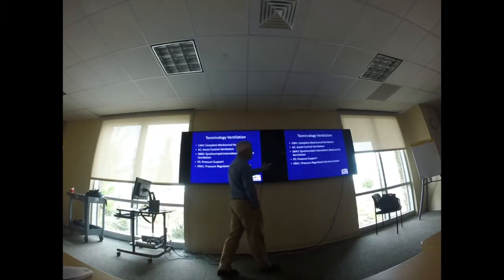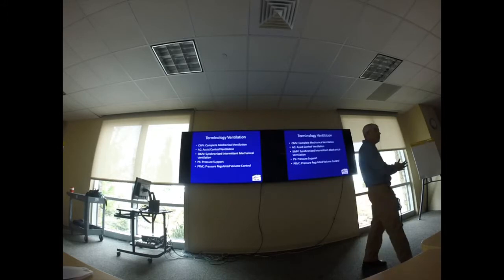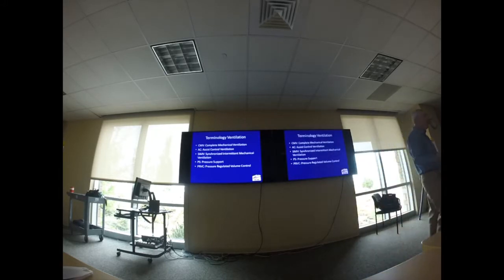So on assist control, he triggers a breath, it's going to give him the 500. On SIMV, he triggers the 13th breath, and he's able to take in whatever he wants at that point. Does that work for you guys?